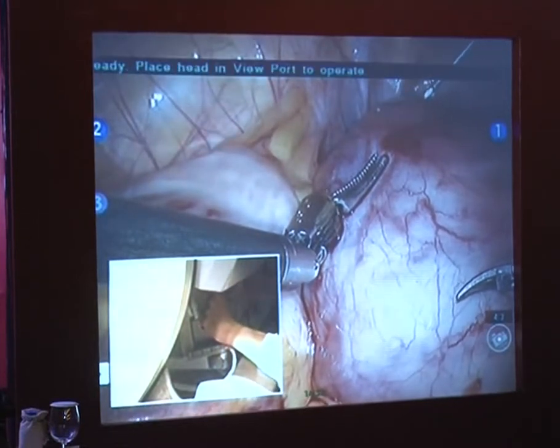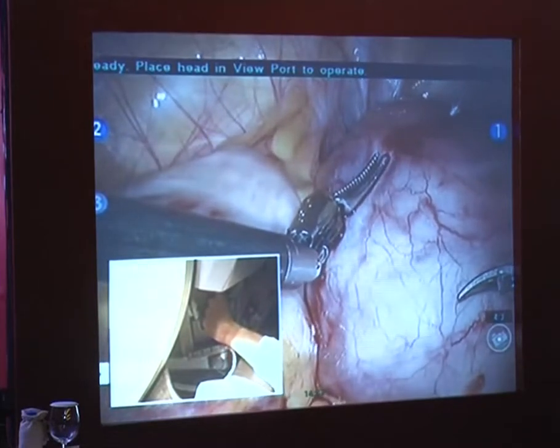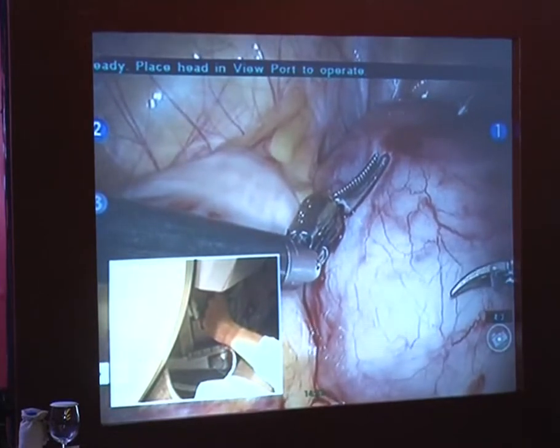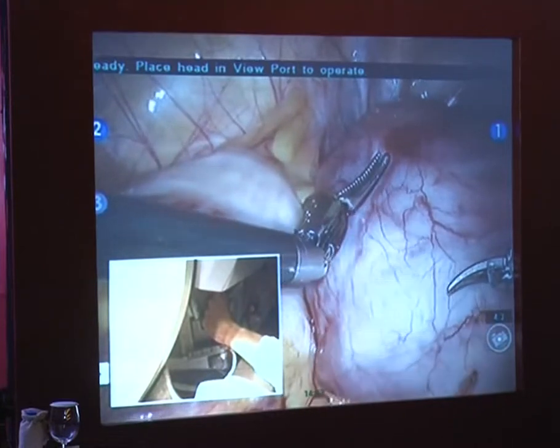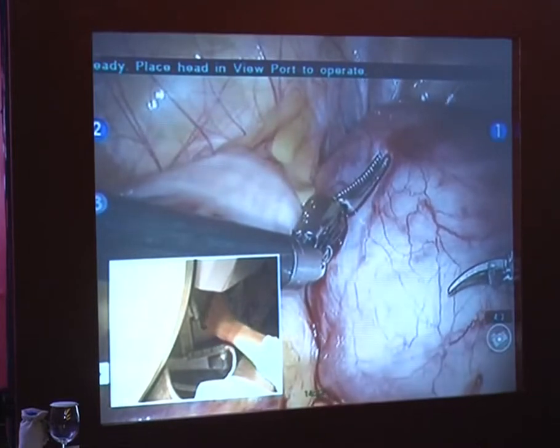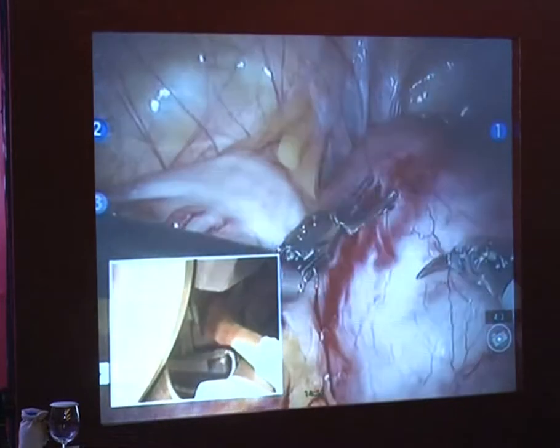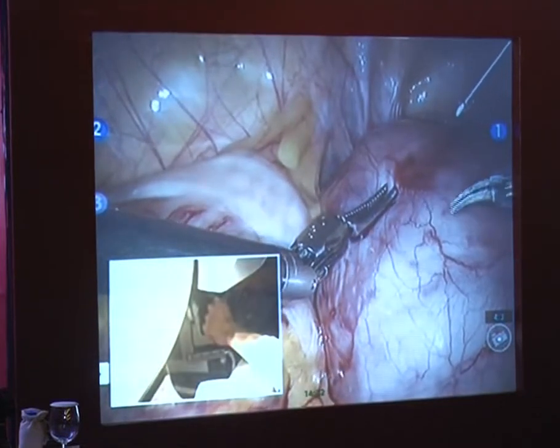I see we get reasonable blanching now, which is good. Excellent. All right. I'd love to do a... All right, I'm going to go ahead and make a vertical hysterotomy here. Let me just get the suction ready.